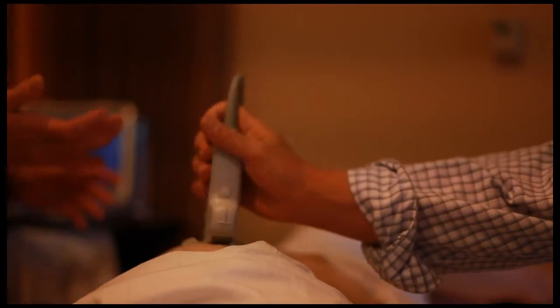This gives them the confidence to take the first step. You can ask questions, learn how to use the machine, learn how to use different aspects to better identify pathology.